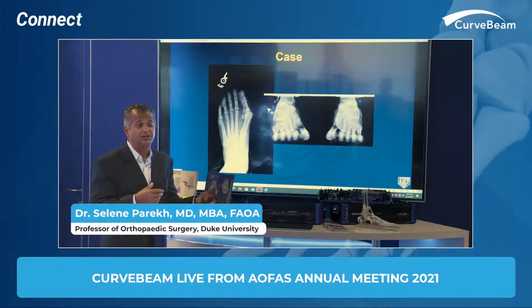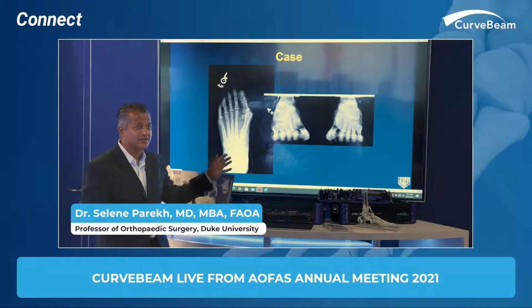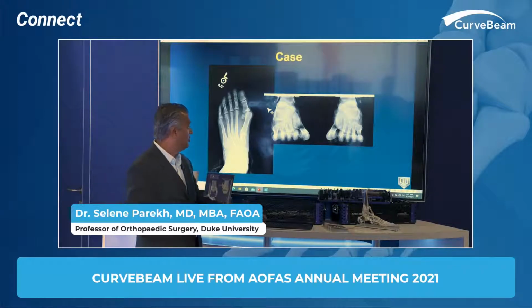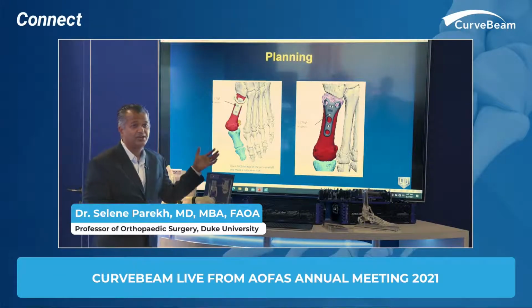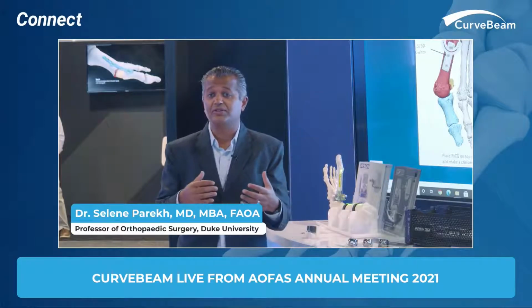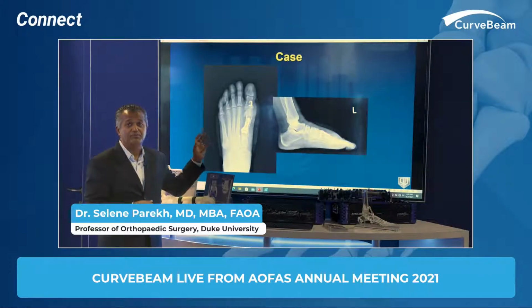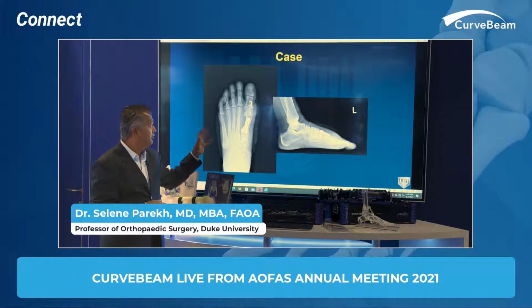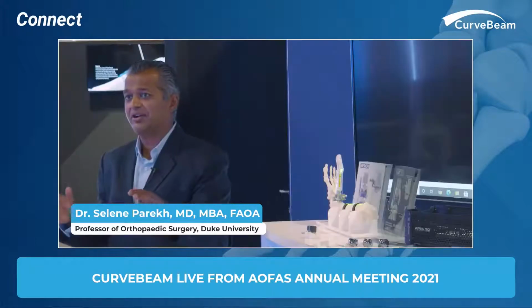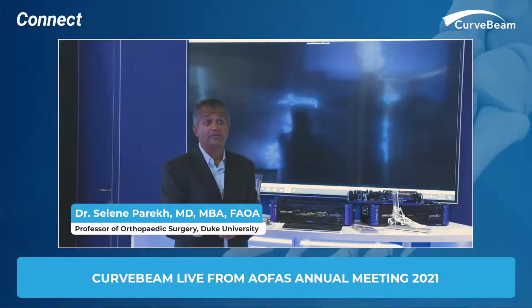If you're a believer in the three-dimensional bunion, you can get x-rays. This doesn't tell you exactly what you need to do in the operating room to correct this patient's deformity. So we can actually get a weight-bearing 3D scan, understand the level of rotational deformity, and then create the three-dimensional bunion correction in the right position, a right rotation, so that you get the sesamoids corrected and aligned as you would like. A lot of the companies are talking about this rotational deformity with bunions. Not all of them have it, but a lot of them do.